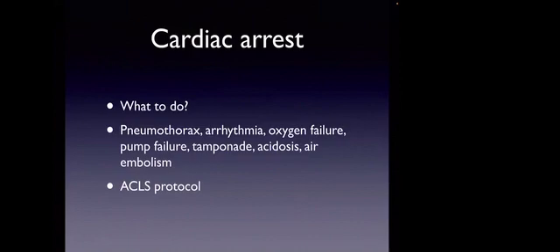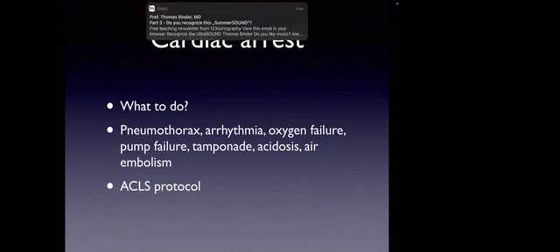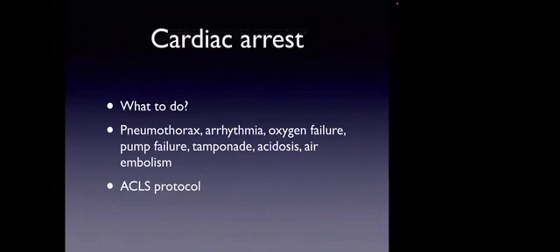It can be some arrhythmia. It can be an oxygen failure, but oxygen failure usually gives a very loud alarm, which is difficult to miss. And pump failure, that means the pump has stopped. If the pump has stopped, then there is something called a hand crank, which can be used immediately. And all nurses, physicians, and perfusionists working in the ECMO unit should know how to use the hand crank.